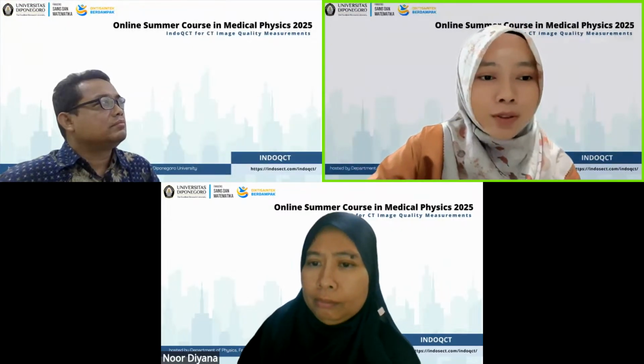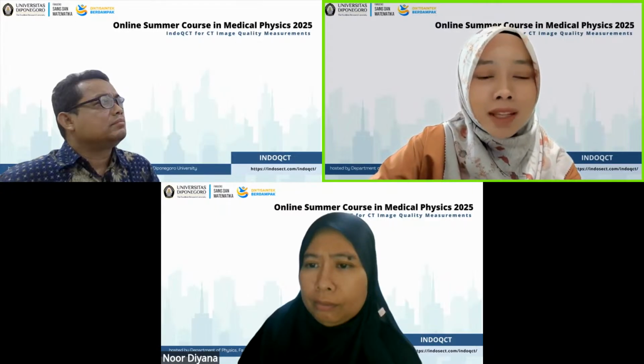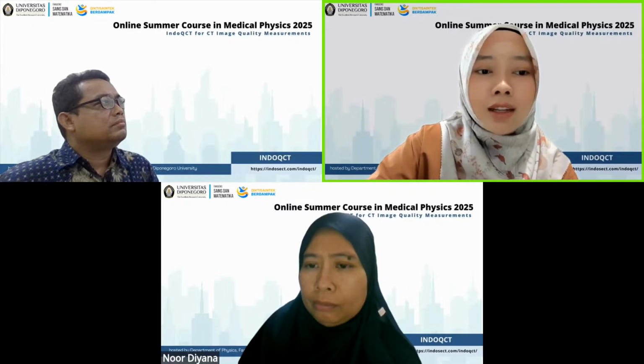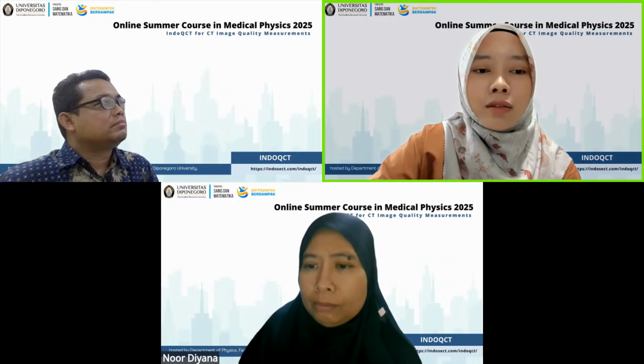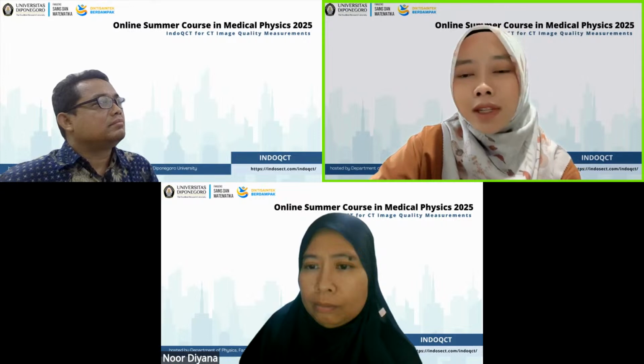We move to the next question from Mr. Wahyu Hutomo. Mr. Anam recommended that we use high-dose scanning parameters because the spatial resolution is prone to noise fluctuation. So, what are the recommended scanning technique factors, kV, mAs, etc., for this measurement?